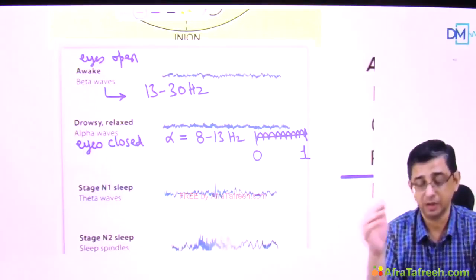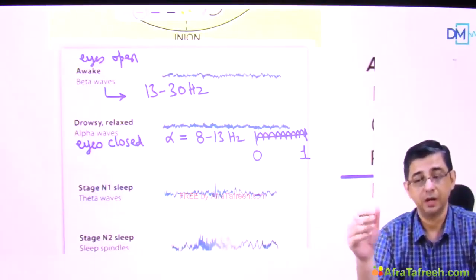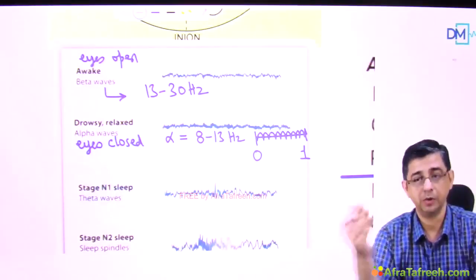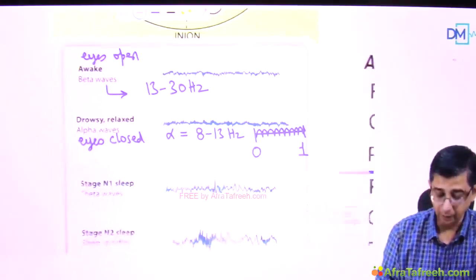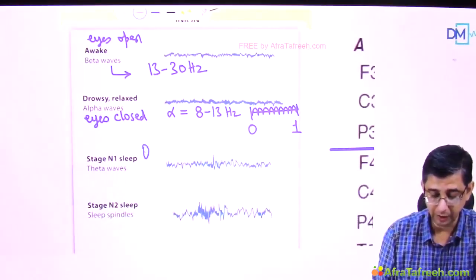So that is why I was saying that if you record EEG for 24 hours or longer duration, that is video EEG recording, it is superior to the recording that we do on paper, because we can monitor the patient for relatively longer durations. Now as we go into sleep, our brain rhythm tends to become relatively slow, and we go into what is called a theta rhythm.